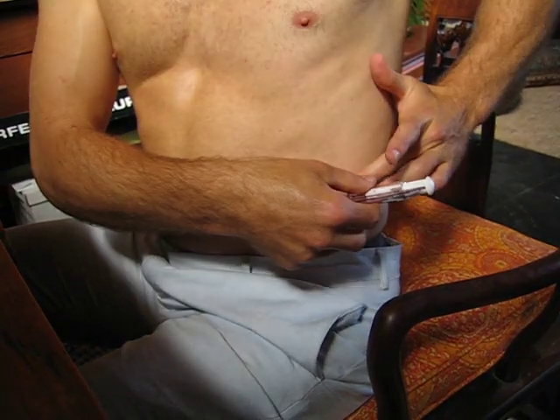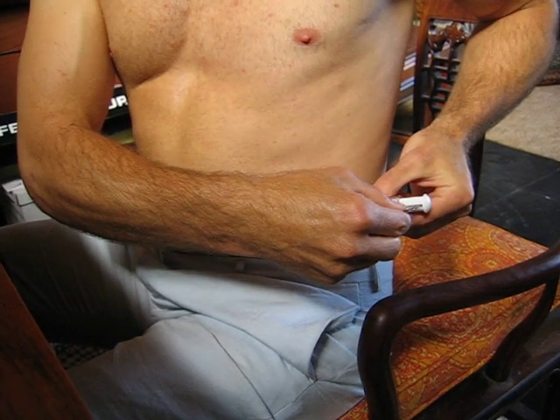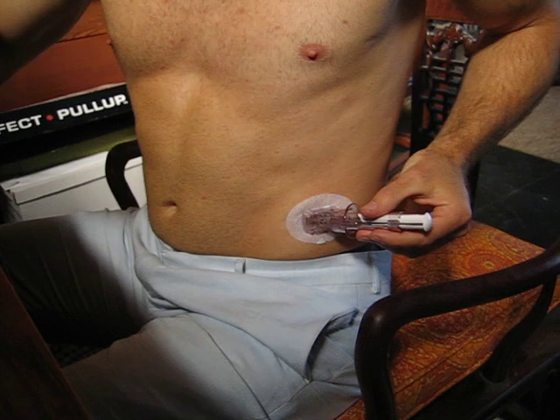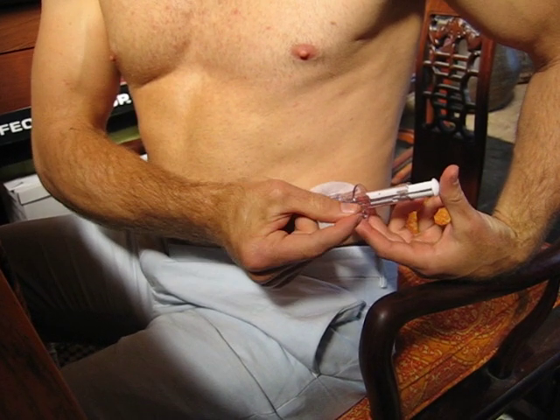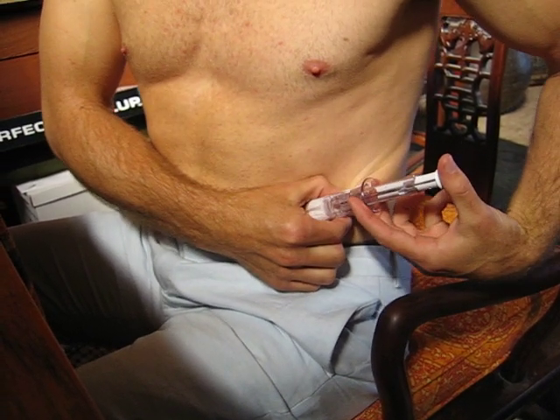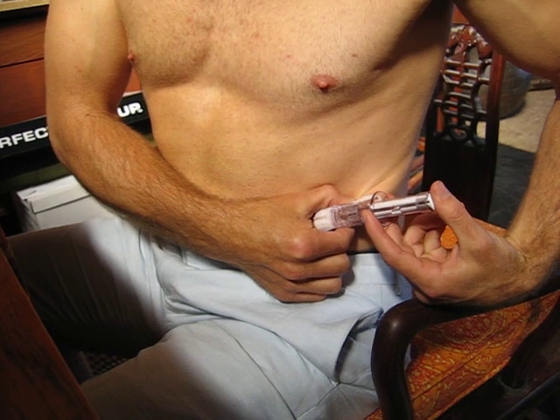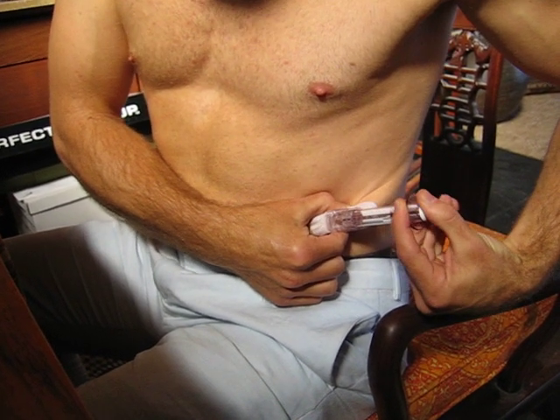Hold the barrel and the arrow, then pull straight out — this is the lock, which prevents you from prematurely deploying this somewhere you don't want it. Now pinch up your skin with your right hand, like taking a caliper. Then push down the white plunger — the needle's going to insert. And then pull up on the collar to meet your thumb, all the way up. We're done.